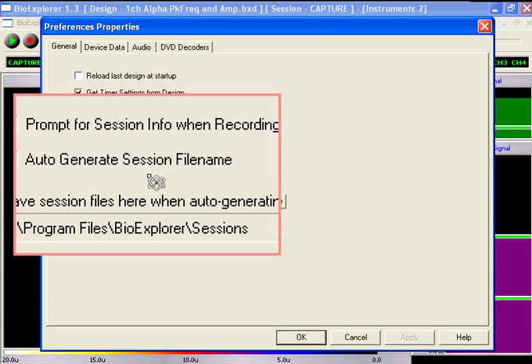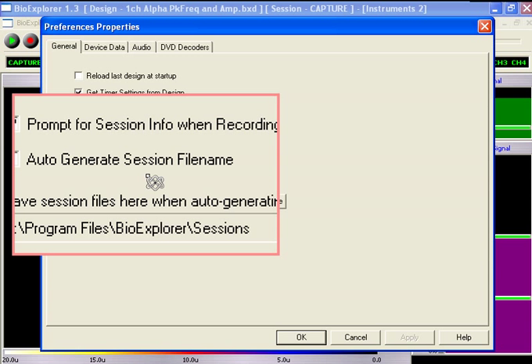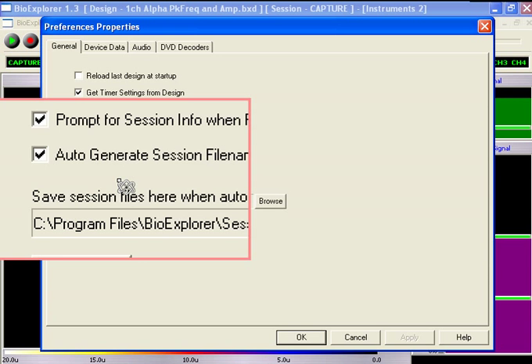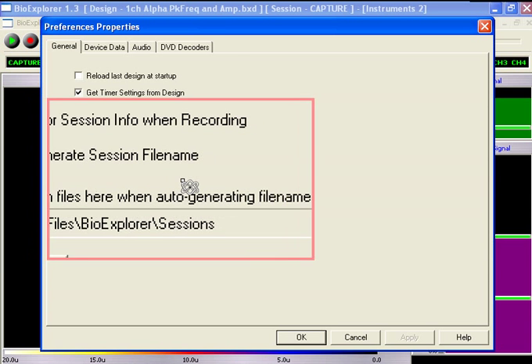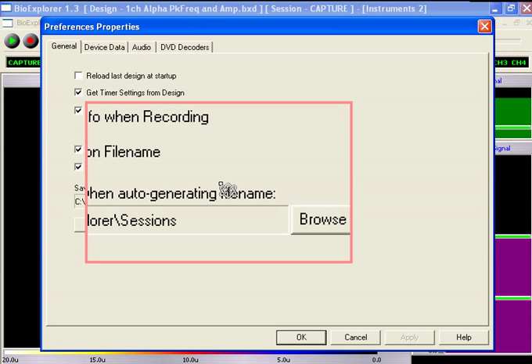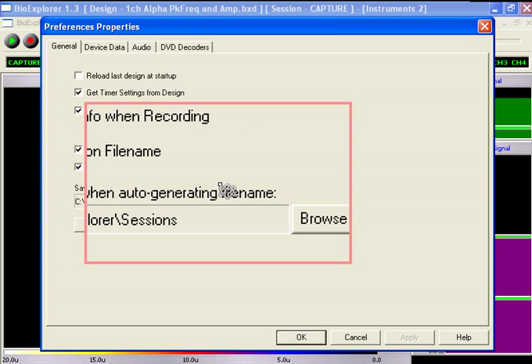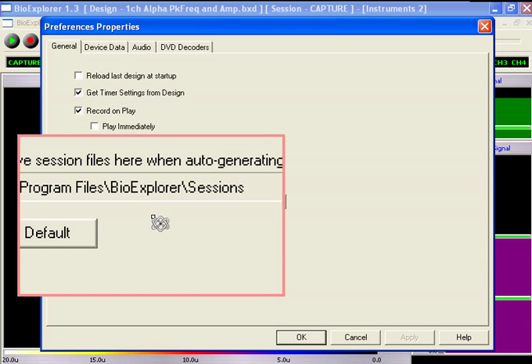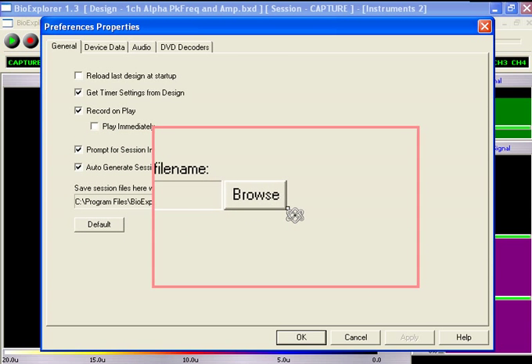Auto-generate session file name will automatically name each file that's generated. Save session files here when auto-generating file name. Bio Explorer's Sessions folder is the default, but we want to direct our data files to the individual trainee's target folder.